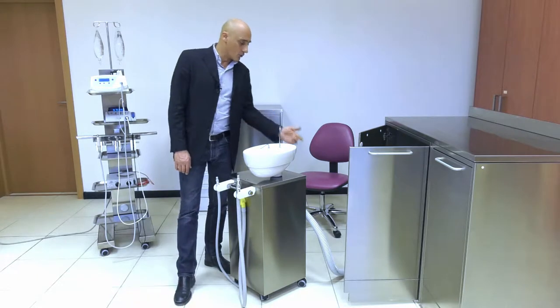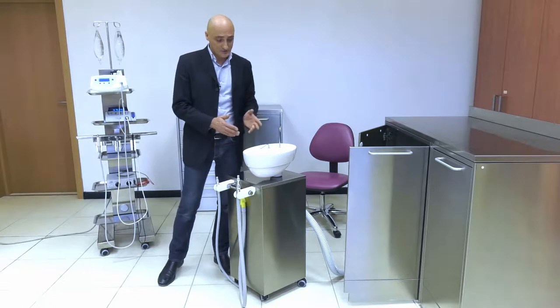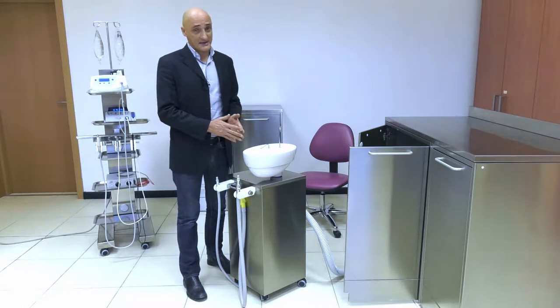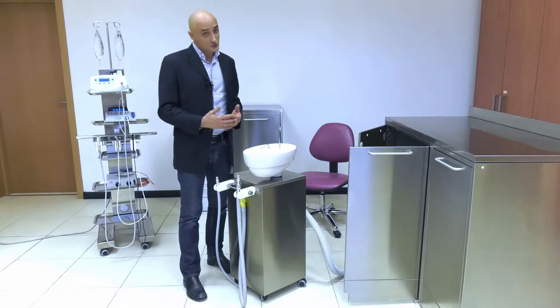Some will ask how a top-to-top connection can allow the Aspirol to drain properly. Please watch the video until the end — you'll get your answer.